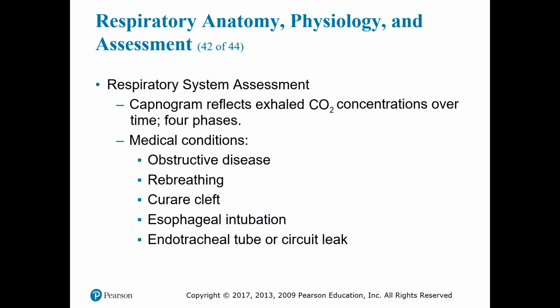The VQ mismatch, as it occurs in pulmonary embolism and similar conditions, the increase in dead space ventilation causes a decrease in end tidal CO2 levels throughout the entire respiratory cycle.